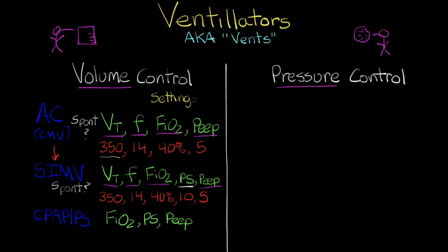On CPAP or pressure support, this is all spontaneous effort of the patient. So every breath that they take, they're going to be triggering every single one of those breaths, and we are just going to be supporting them with some pressure support and PEEP. And again, we're going to be providing an FiO2 for that patient.